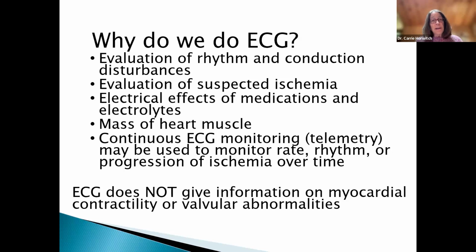What we do not get from an EKG is any information about how well the heart functions. So an ejection fraction, that's from an echo, not from an EKG. We can't really determine any valvular abnormalities or anything like that on an EKG.